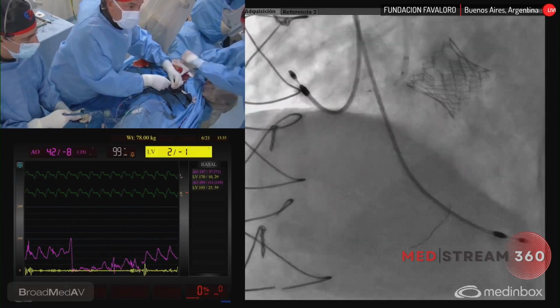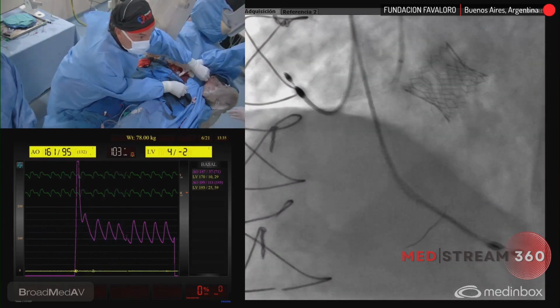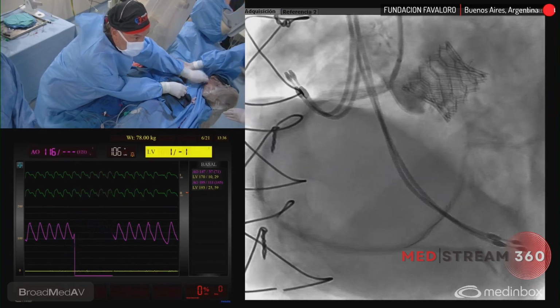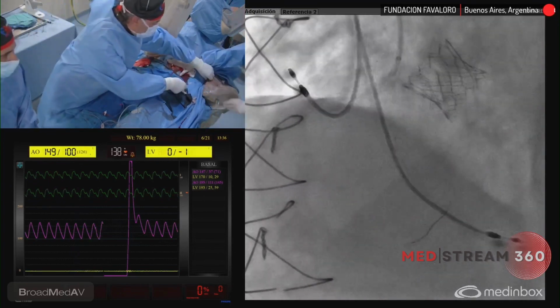The guiding proximal. Okay, in fact, the guiding is not perfectly engaged, but I don't like the distortion of the stent with the guiding, which is prolapsing. Now I think it's much better. We have used 3.5, a very high pressure. We have had many problems, so I think we are done with this.